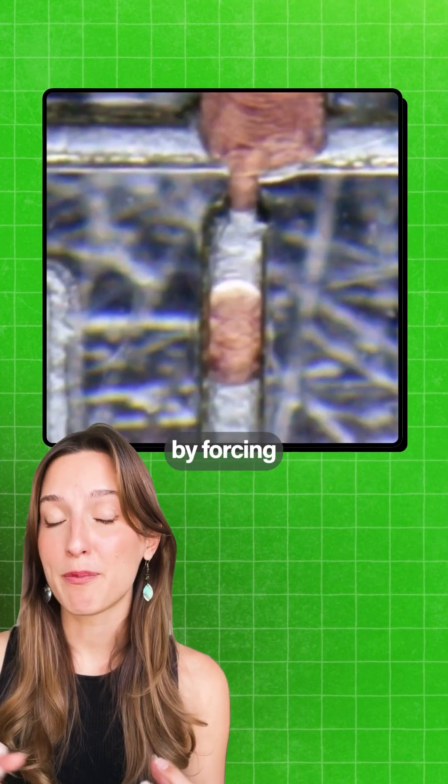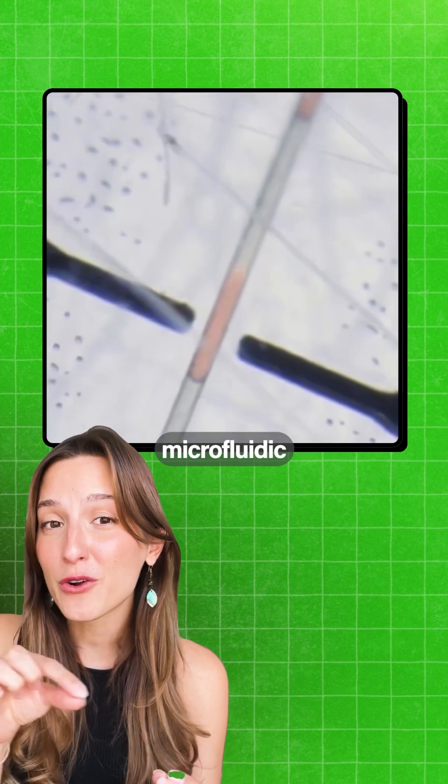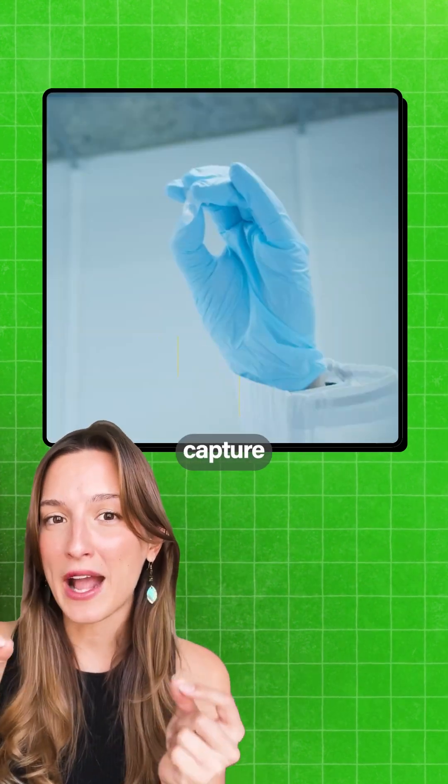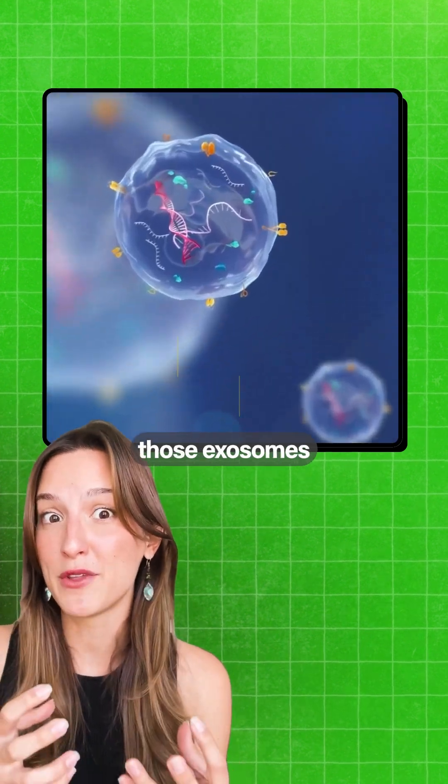Crave intersects those packages by forcing urine down microfluidic tracks and then has designed a cellulose nanowire, tiny little capture mechanisms in order to grab those exosomes.